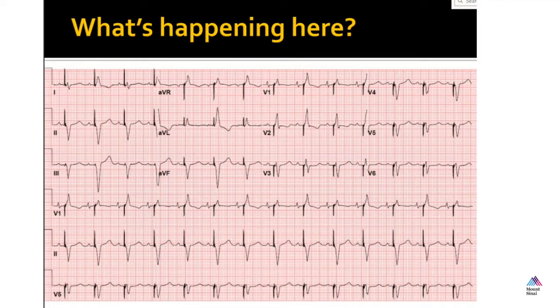And so you're basically saying that normally the sinus node in patients is variable depending on the level of adrenergic stimulation. And so the heart rate will change based on sinus changes. And so the V-paced rate would vary with the atrial rate. In other words, because in a dual chamber pacemaker there is AV synchrony, in someone with a normal sinus node you would essentially have a sensed V-paced rhythm. And so if the atrial rate went up, like with exercise, we would expect the V-pacing rate would keep up with it and vice versa.